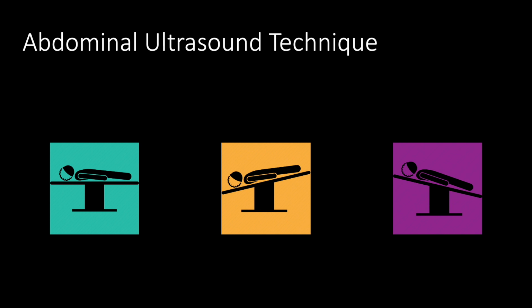And so generally it's going to be supine, but keep in mind that you can manipulate your patient's positioning to better increase the sensitivity of your exams.